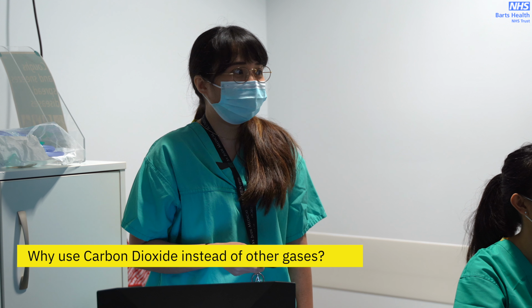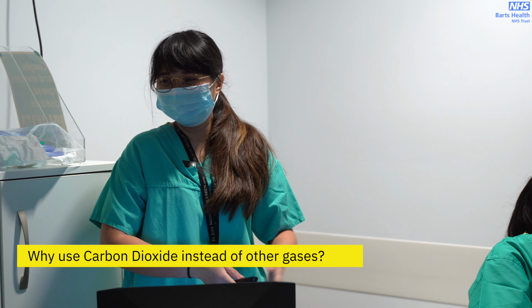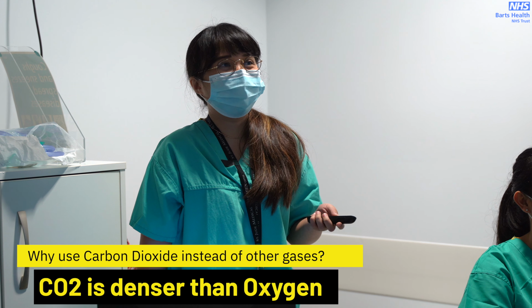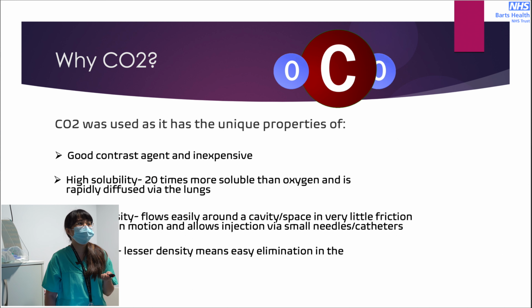So why CO2? Any ideas? Denser. Because it's not oxygen. Oh, very good. It is denser, and there are a lot of reasons. It's a good contrast agent, and it's inexpensive.